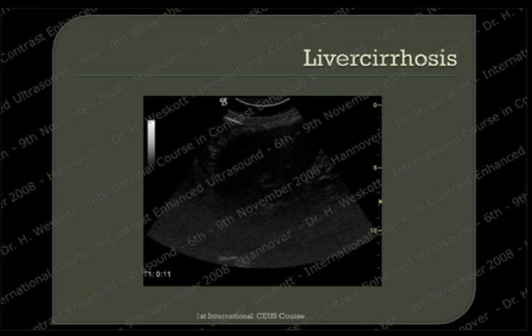And the last example is a patient with a liver cirrhosis. Just see, this is the portal vein, here's the artery, and now you see the liver vein, and the liver vein fills prior to the filling of the portal vein. The portal vein is still unenhanced, and now you see the first bubbles appearing in the portal vein. So this is due to shunting. This is not an end-stage liver cirrhosis in this patient. This patient had a Child stage of 2 at that time. But you see the kinetics have totally changed in this patient.